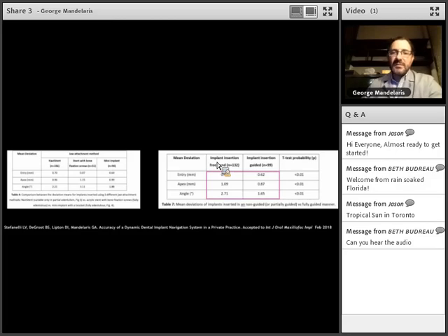Because when you look at Luigi's numbers, when he placed the implant not guided, freehand, but he had created the osteotomy site using dynamic navigation, his numbers were a little worse, but not too bad. 0.77 millimeters versus 0.62 millimeters. What did happen is the implants were placed a little deeper than when they were placed using dynamic navigation. Again, you're talking 0.2 millimeters. That's even difficult to measure.